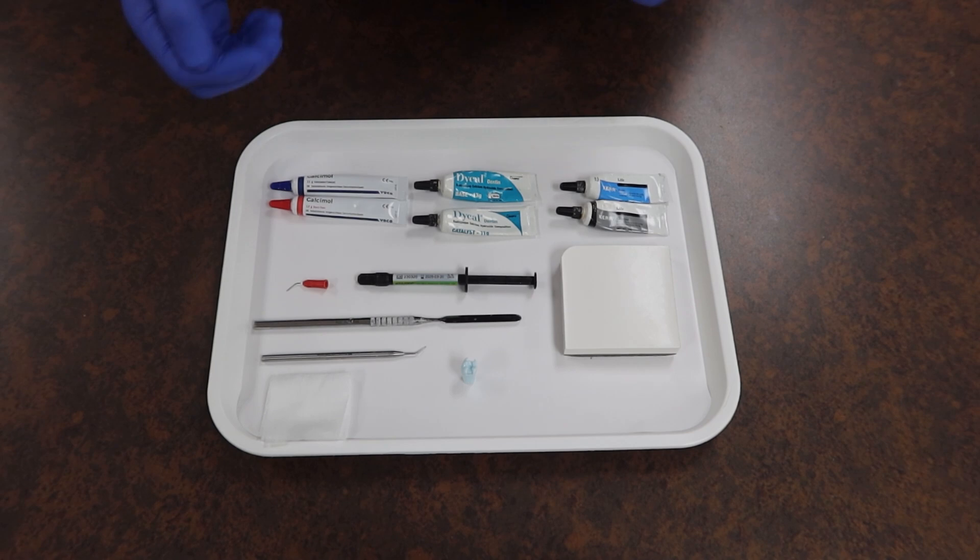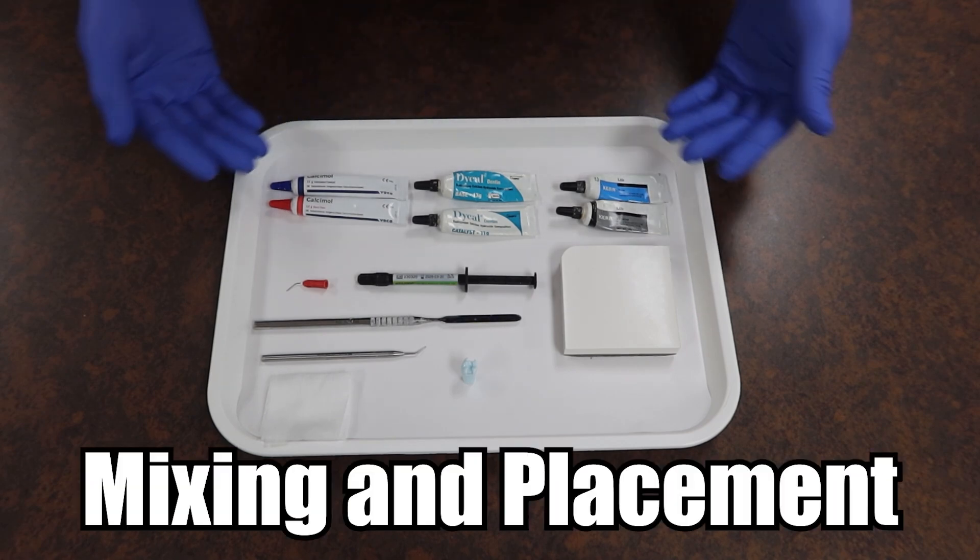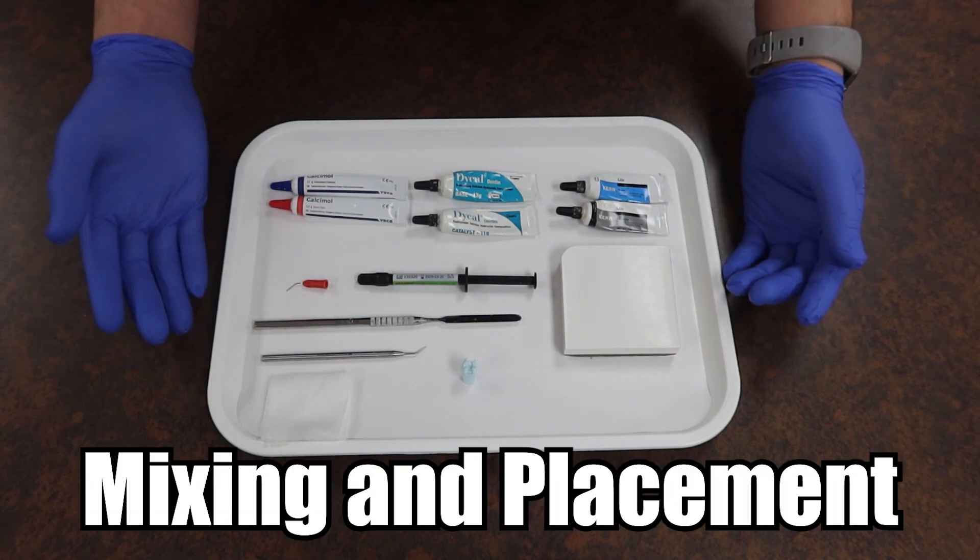All right everyone, welcome back to Dental Things. Today's concept is we are going to be going over the act of placing a dental liner.